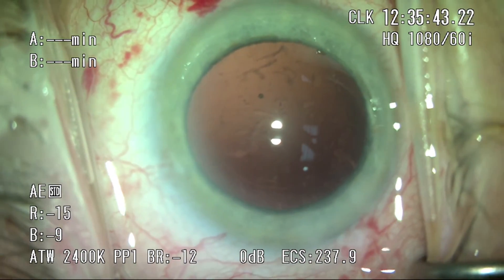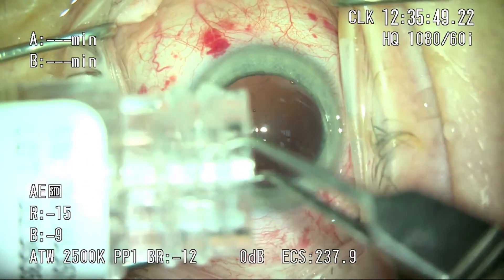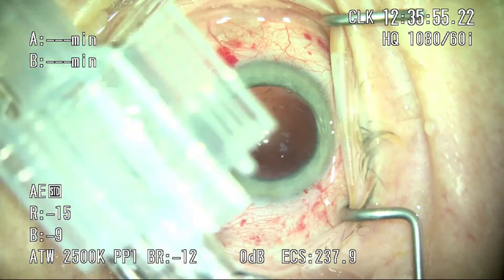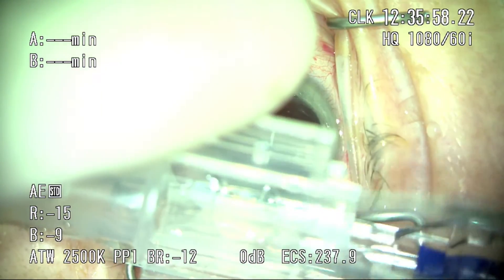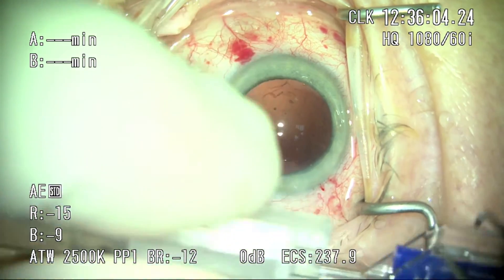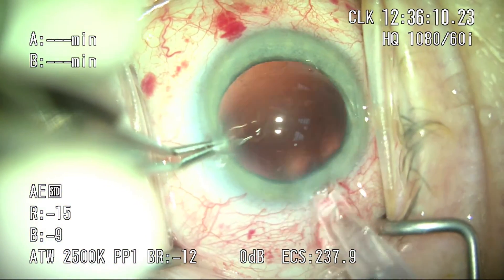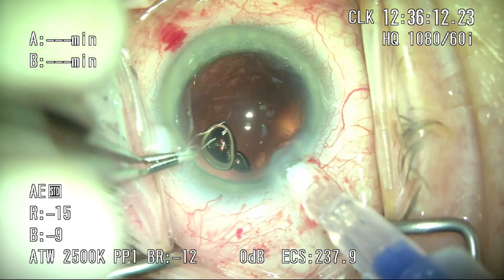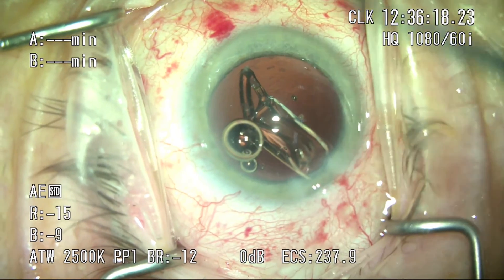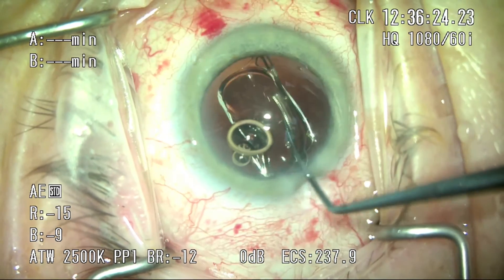I'm going to go off-screen and grab my lens — I do like to load my own lenses. In this case I'm using the Envisita lens, a new hydrophobic acrylic IOL approved by the FDA as being glistening-free. I've been using this lens for about six months, implanted about 100 lenses, and I'm very happy with the results. The acrylic is tougher than other hydrophobic acrylics we're used to, so it takes a bit more manipulation to load and longer to unfold in the eye. I'm doing a wound-assisted insertion through the 2.2 mm incision, and all these lenses go through without enlargement.